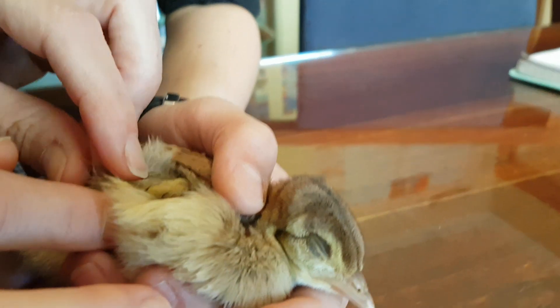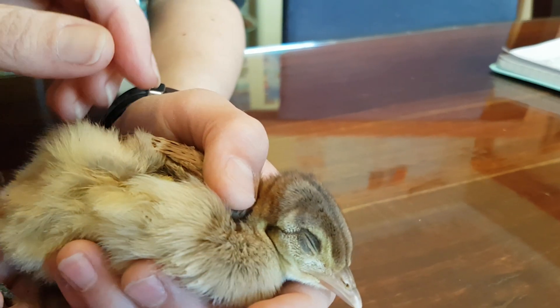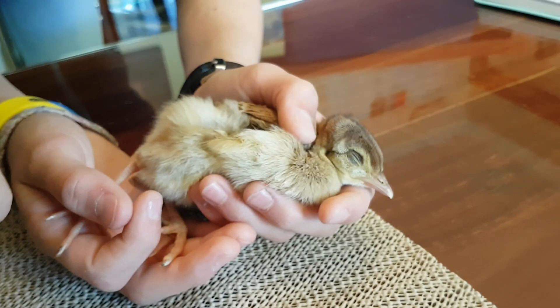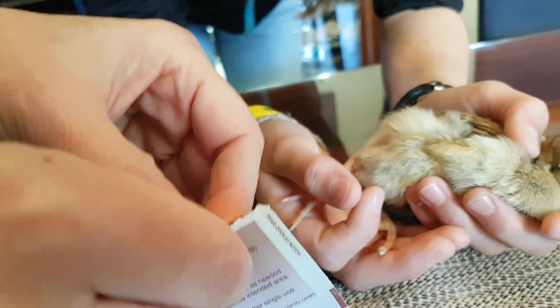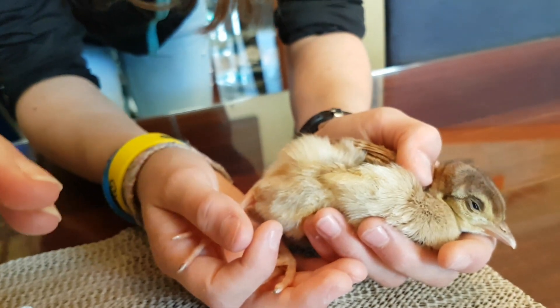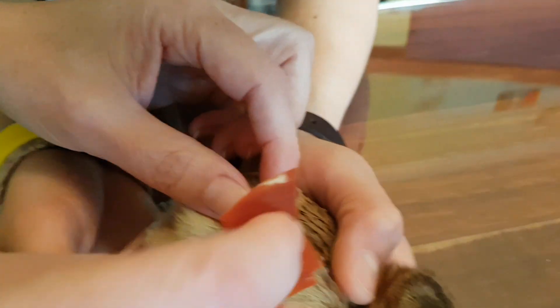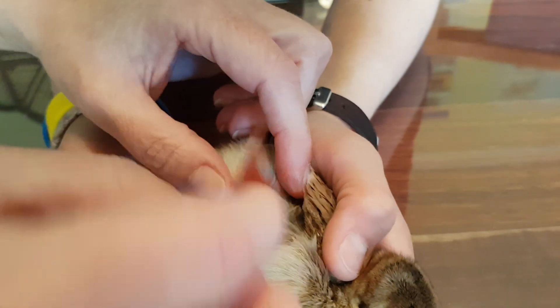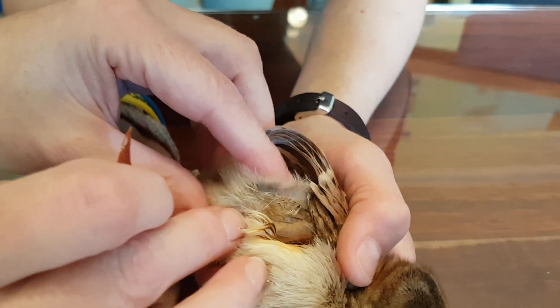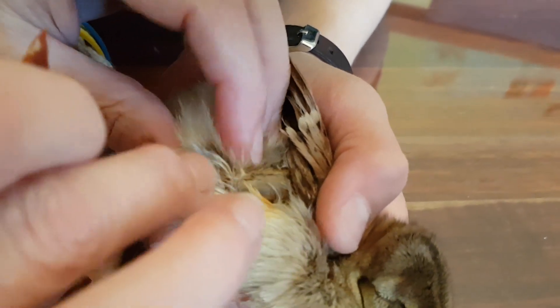This is such a relief for her. She's only about three or four days old at the moment, so this is not the best thing to have happen to her, but she should be fine and she should survive now. I'll put the cap on the needle. And give her another wipe — this is an iodine wipe, which will make sure we don't get any infection in that tiny little hole. We're going to have to check her each day and put some more wipe on her. There is still some air in there — you can actually push the air to that section.